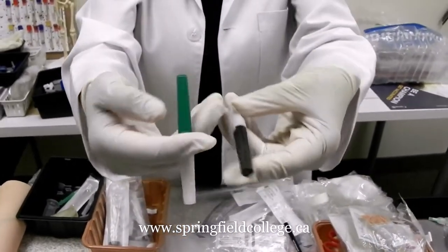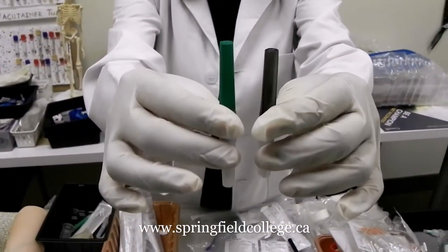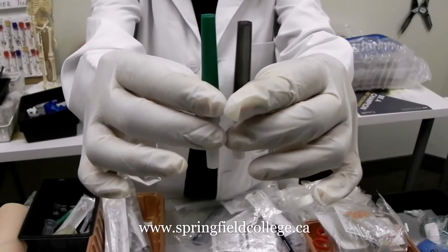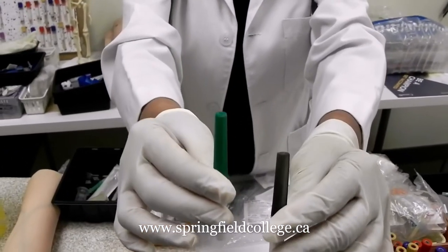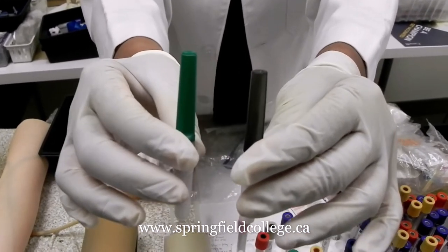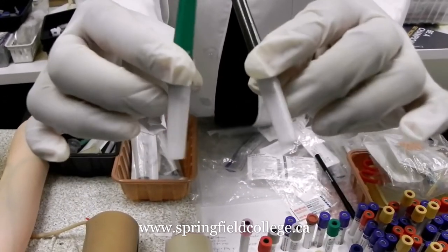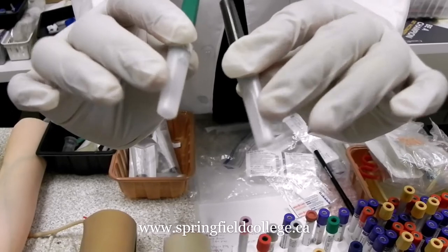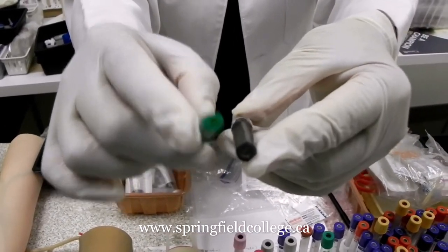Second come the needles. The commonly used needles for the vacutainer system are 21 gauge, which is green, and 22 gauge, which is black. So 21 and 22 gauge are the most commonly used gauges. On the other side it is a white one, and this side is the color-coded portion.